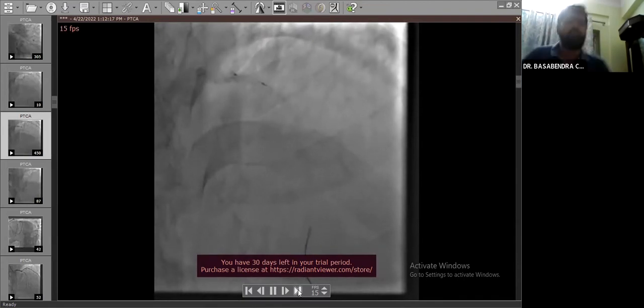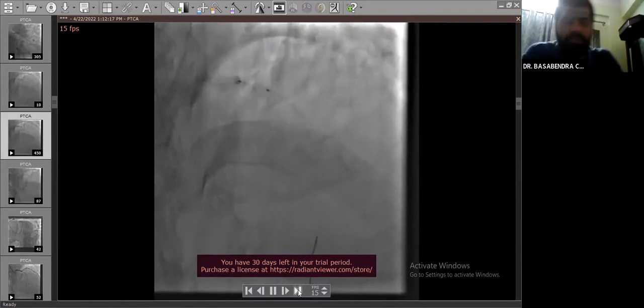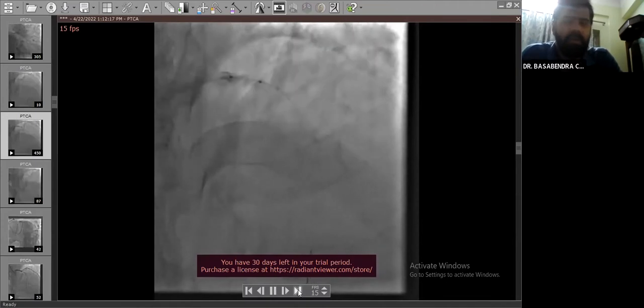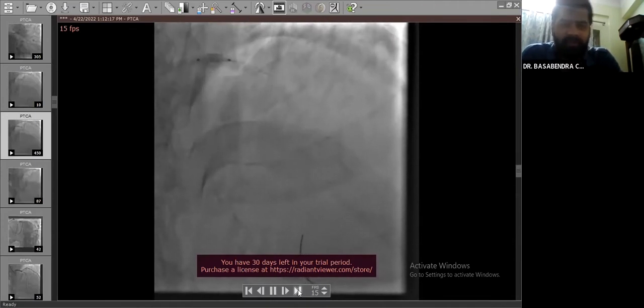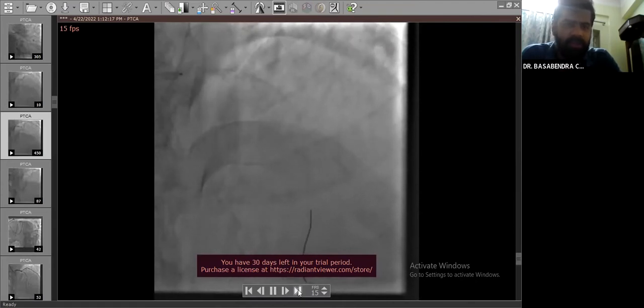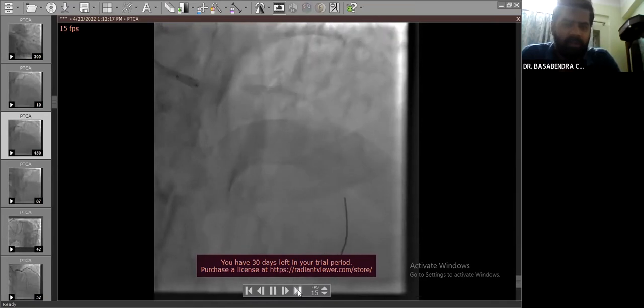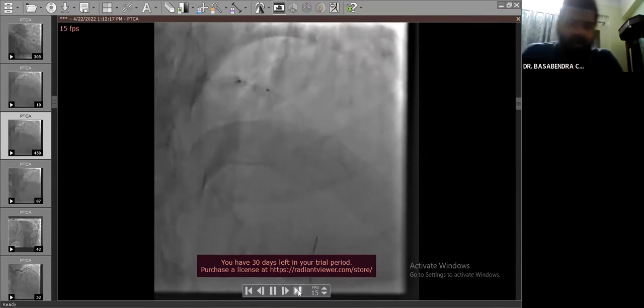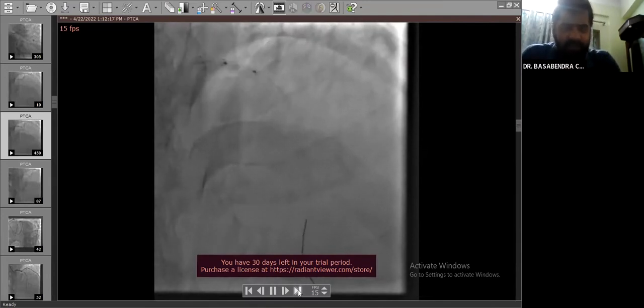Balloon was taken just distal to the dislodged catheter tip. Then a very low inflation was given at around 6 atmospheric pressure, and as you can see, the tip got trapped, and as the balloon was pulled back, it went inside the catheter. And after that, the pressure was increased to around 14-16 atmospheric pressure, so that it cannot escape further towards the artery and remains trapped inside the catheter.